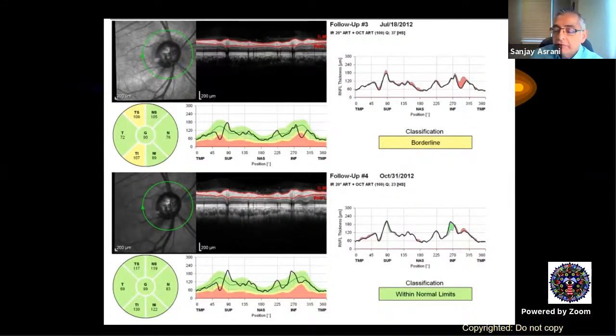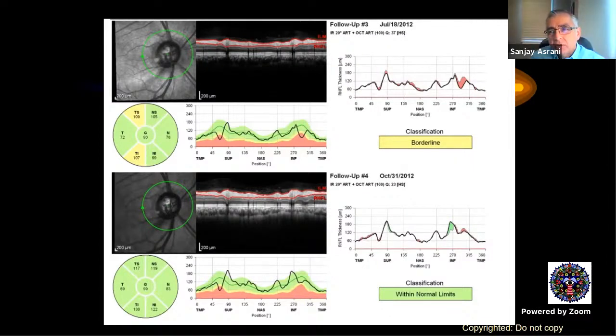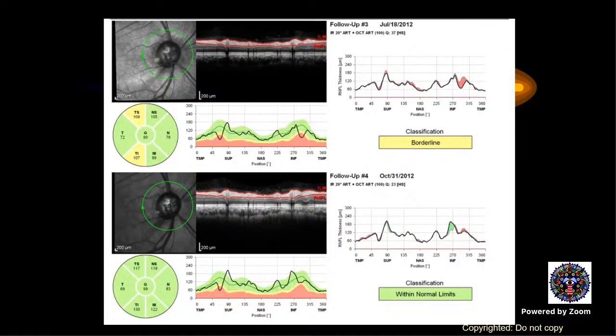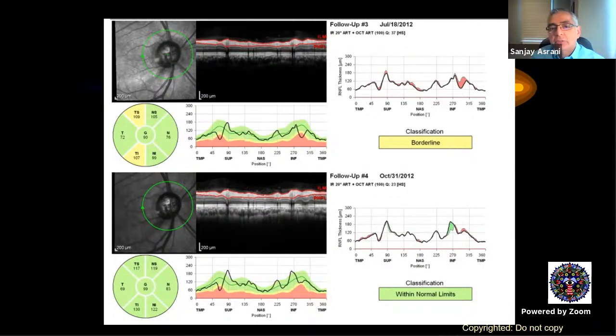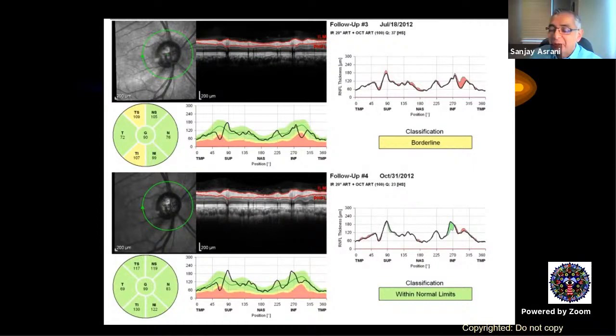Any of the residents who are live? So if there is any media opacity, maybe the patient has developed cataract over time, but it wouldn't be focal, no? It wouldn't be focal. Sir, any cataract would cause a global distortion. There would be a change in the quality of the image. Beg your pardon? If there is any edema accumulation in that area, which increases the thickness of the nerve fiber layer. Very good, very good. I'm glad you have read up something about it.